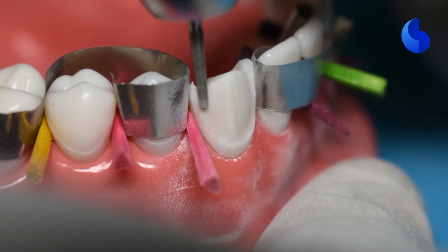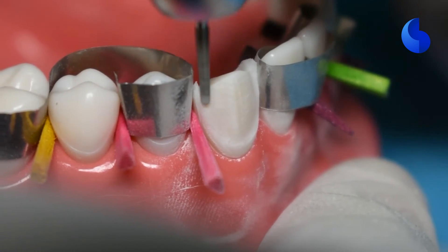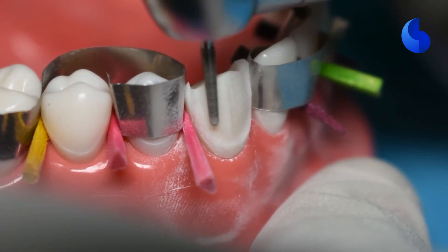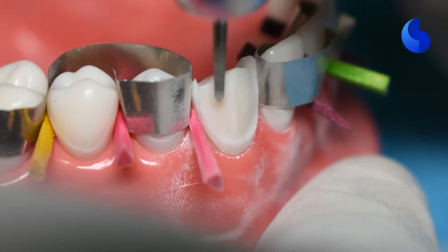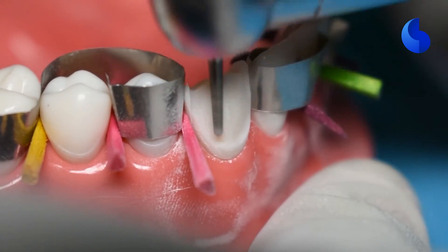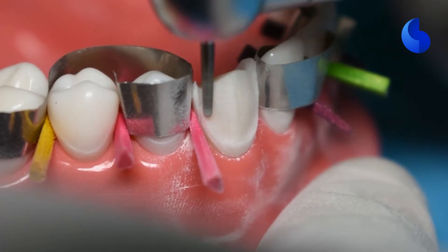As you're doing this, you have to flow your bur along with the gingival margin — it has to be in line with that. We're giving ourselves some wiggle room so that when we start finishing this preparation, we can place our margin 0.5 millimeters supragingivally.